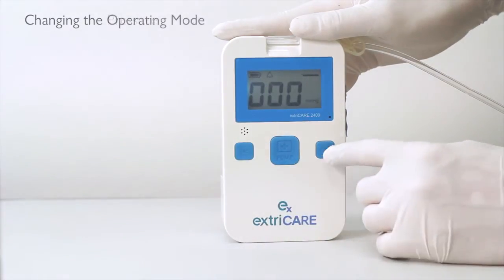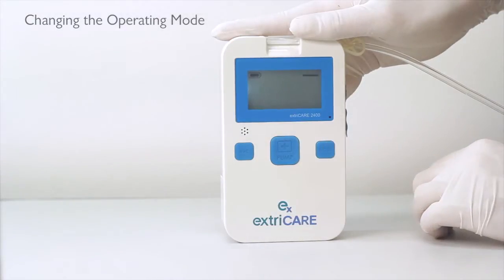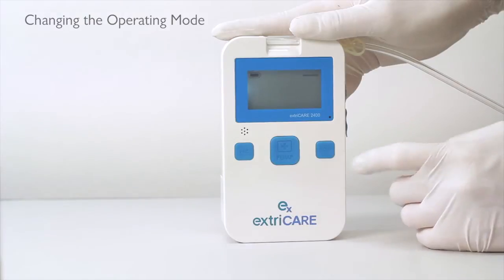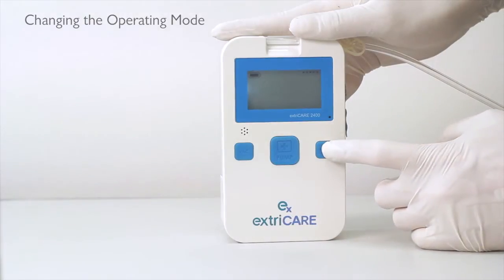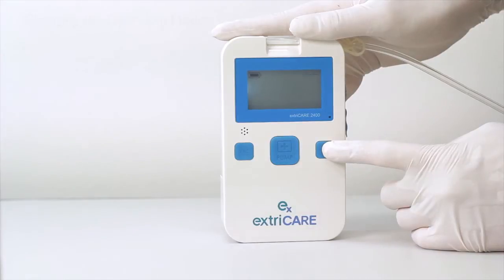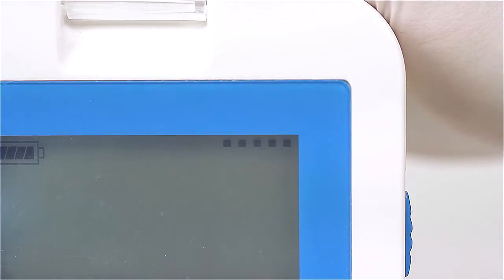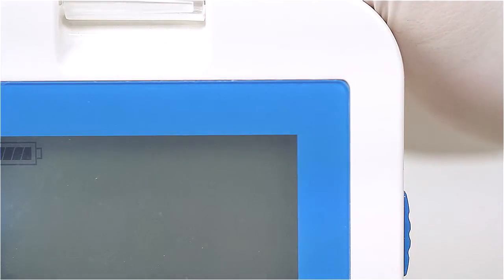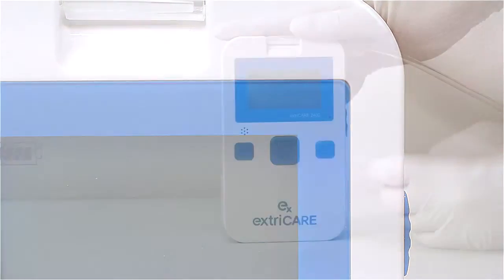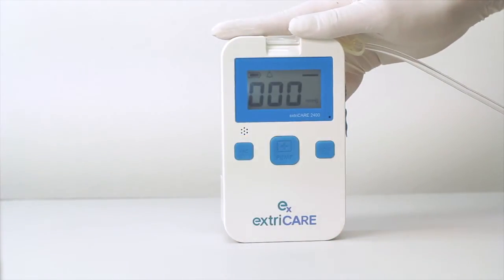To change the operating mode, hold down the MODE button until you hear a beep. After the beep, press the MODE button to change between continuous and intermittent mode. Intermittent mode is 5 minutes on and 2 minutes at ambient pressure. In the top right corner of the screen, you will see a straight line indicating continuous mode or a dotted line indicating intermittent mode.